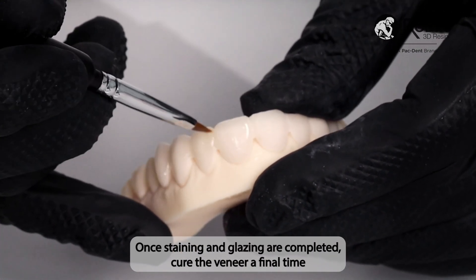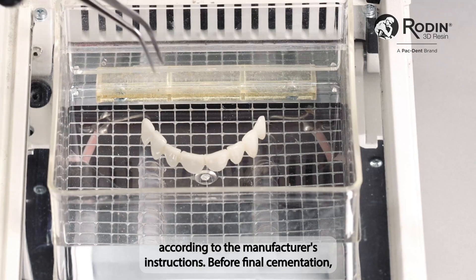Once staining and glazing are completed, cure the veneer a final time according to the manufacturer's instructions.